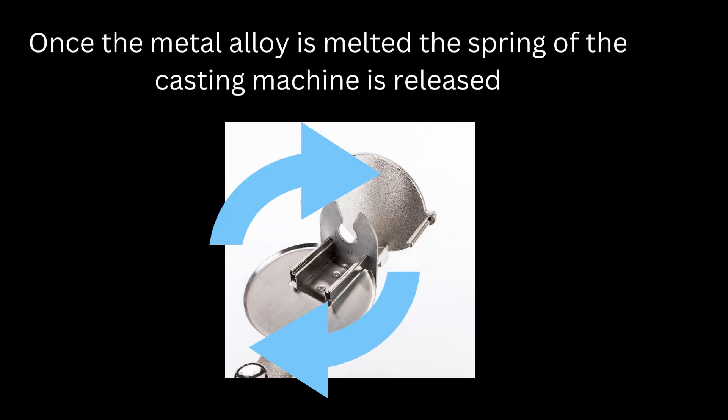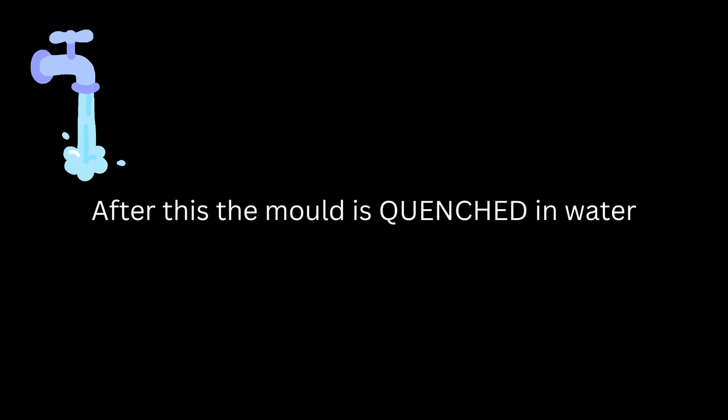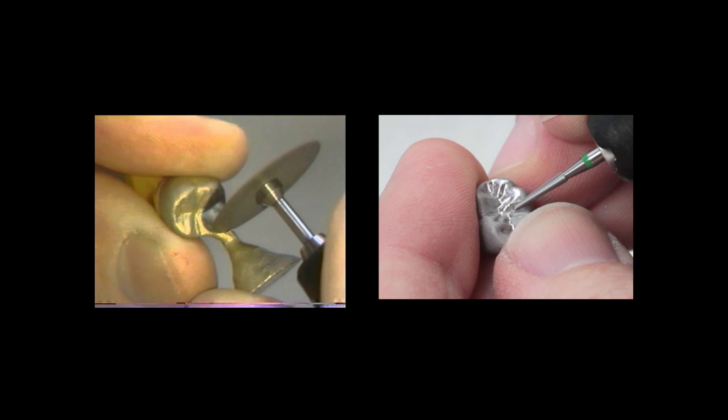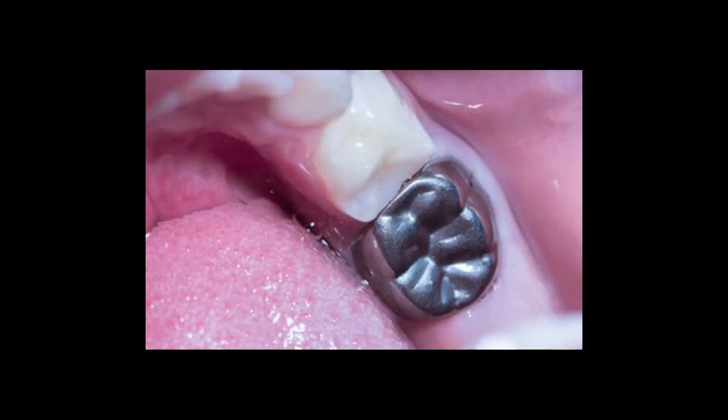The spring of the casting machine is wound two to five times. Once the metal alloy is melted, the spring is released and the machine starts rotating. The molten metal enters the mold due to this rotational action. After this, the mold is removed from the machine and quenched in water. The casting is then removed from the investment, and we do the finishing procedures like trimming, sandblasting, and polishing. It is then placed on the cast to check the fit, sent for trial, and cemented onto the patient using luting cement.